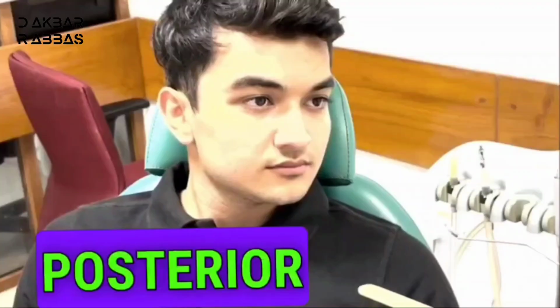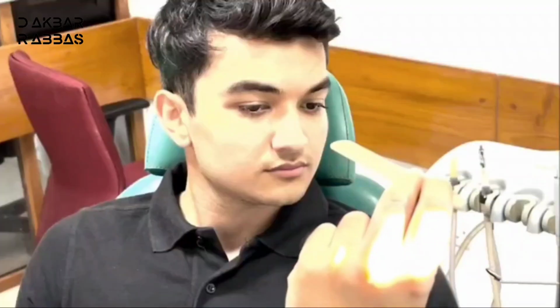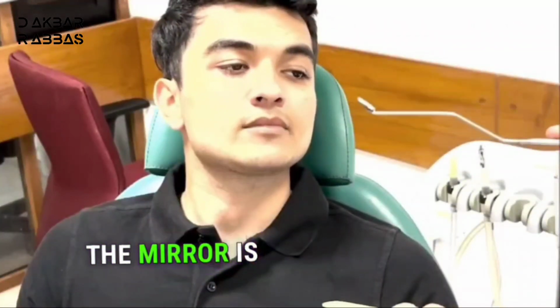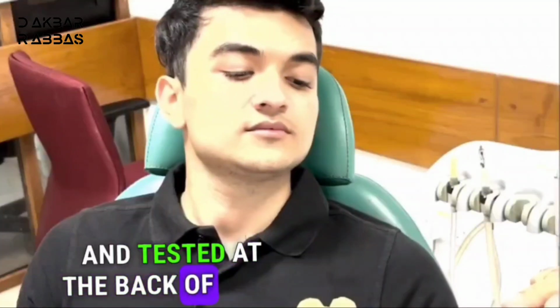Thank you. So we'll be starting off with the posterior rhinoscopic exam, and in order to do that, you should be holding this tongue depressor in your left hand and this posterior rhinoscopy mirror in your right hand. The mirror is always pre-warmed before this examination and tested at the back of your hand and the patient's hand.